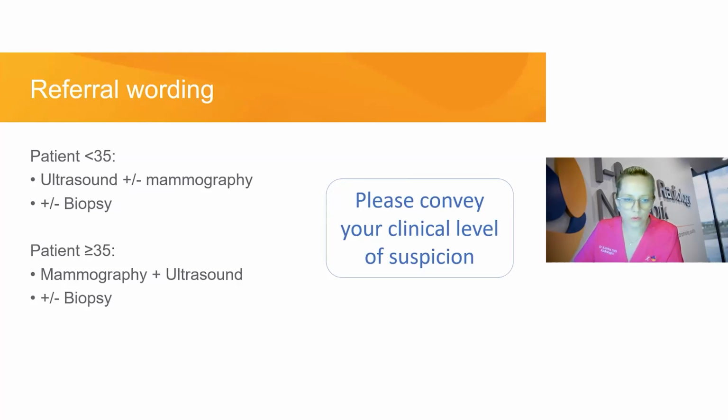The breast cancers that young women do tend to get are often quite obvious on ultrasound. So we do have good sensitivity with that modality, and the mammography is important once we find a suspicious finding, in these circumstances for extent of disease, in the case of DCIS, to look for that calcification. So ultrasound alone can sometimes resolve if it's a categorically benign finding. But mammography is very important to then determine disease and level of suspicion. So it's important to have both components on your request form in that area.